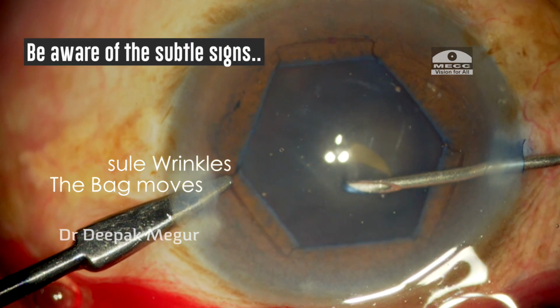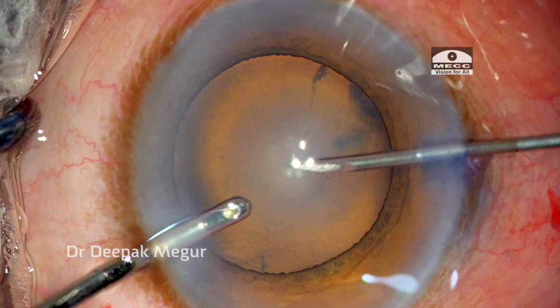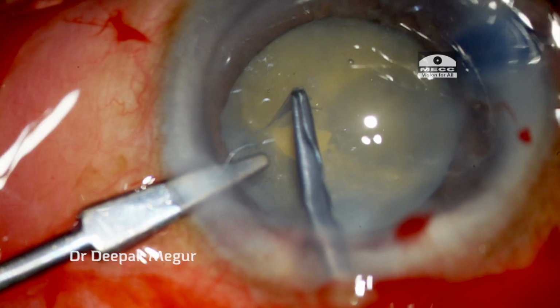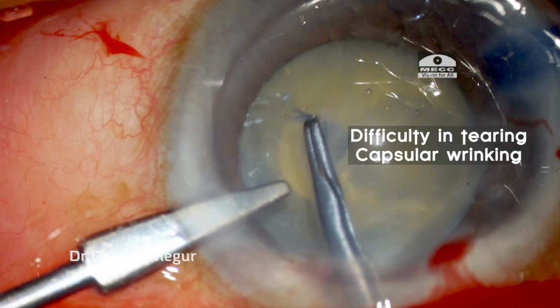As I'm puncturing the anterior capsule, I can see the folds and wrinkling of the capsule. This is a classical sign suggesting that zonules could be weak. In this case of a hypermature cataract, tearing the capsule is difficult and I can see there is wrinkling of the capsule.